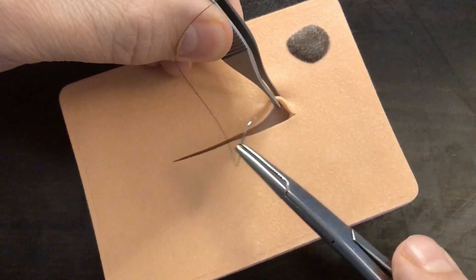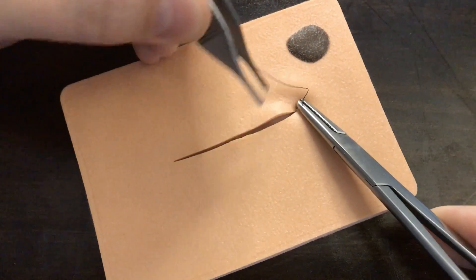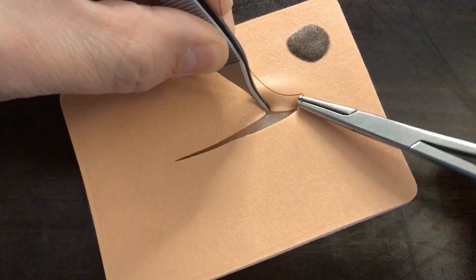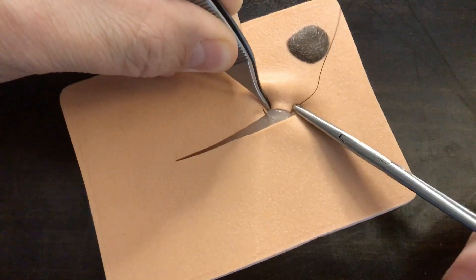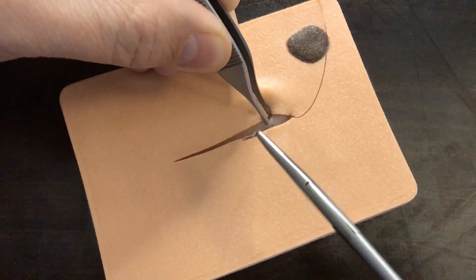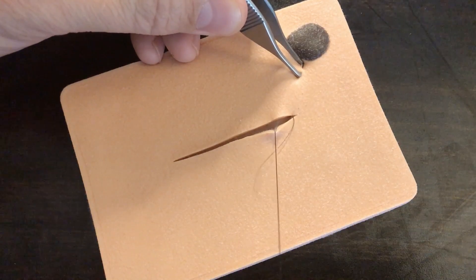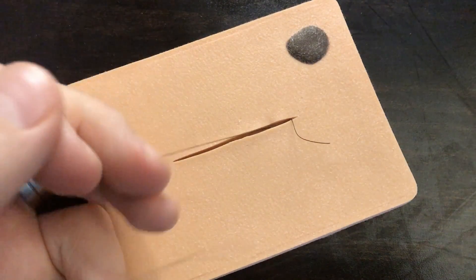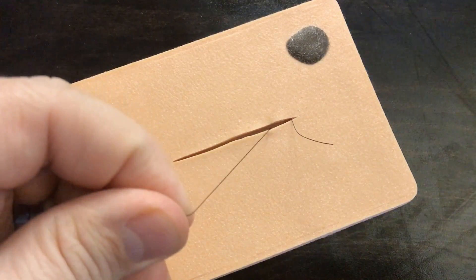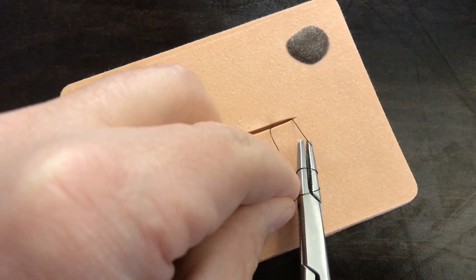But to start this off, the way I like to do this is I like to start with a suture that's somewhere down in the depths. I'm going to grab on to some rather tough tissue there in the depths of the wound where I can anchor in. I'm doing an anchor suture, so it's in the depths. I'm not too worried about skin level at this point. I'm going to go ahead and do an instrument tie. You could do a hand tie if you felt like you wanted to, but I'm going to go ahead and do an instrument tie here.